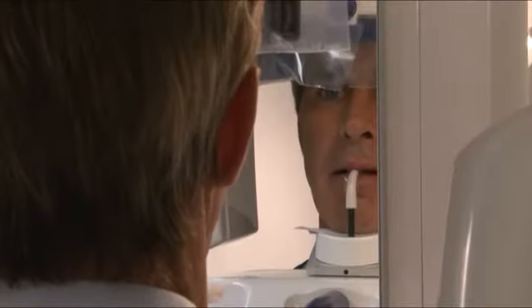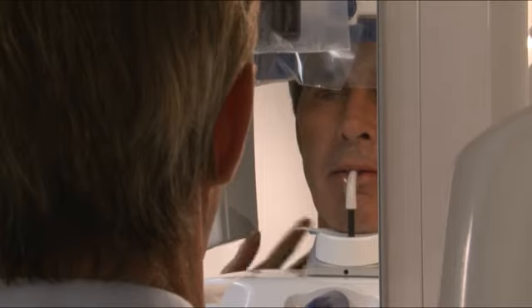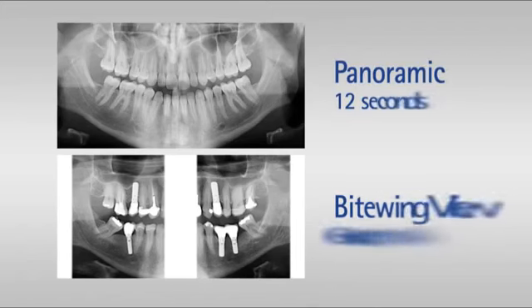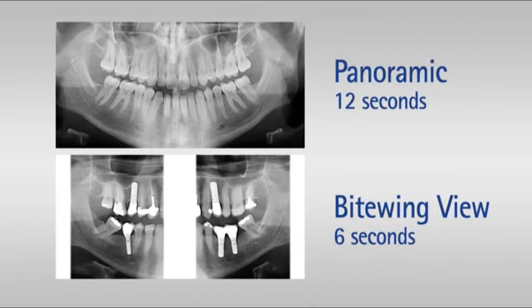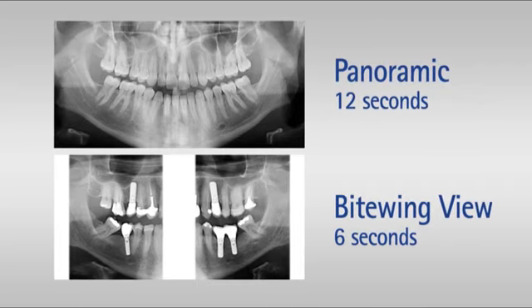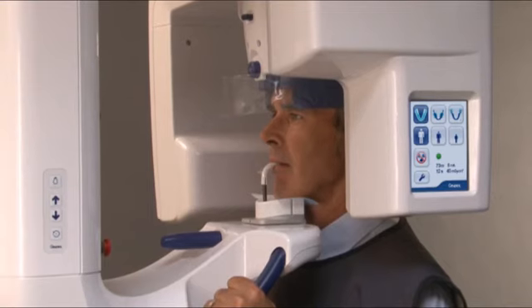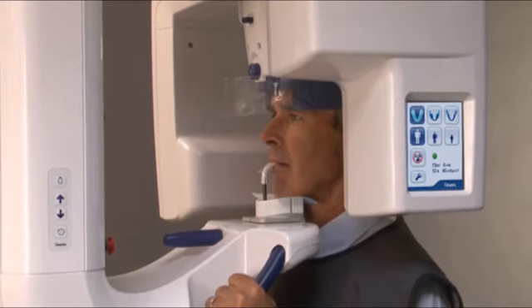Ask the patient to press their lips together and press their tongue against the roof of their mouth. Looking at a fixed point in the mirror will help them remain still for the duration of the exposure. The exposure takes approximately 12 seconds for a panoramic exposure and 6 seconds for a bite wing. Move at least 7 feet away from the unit and protect yourself from radiation.